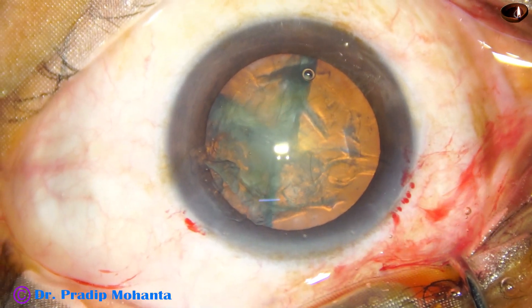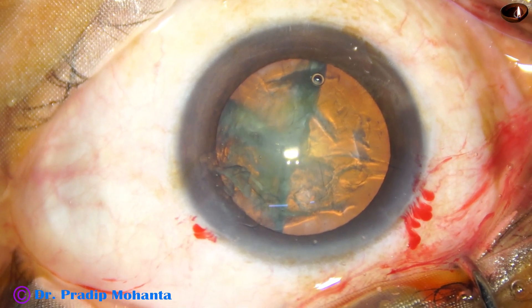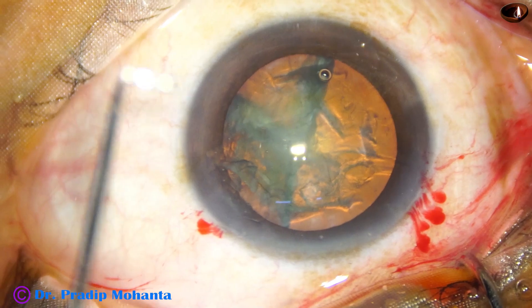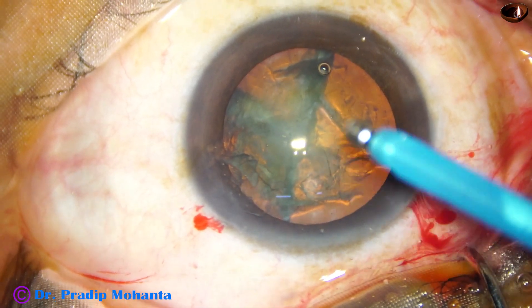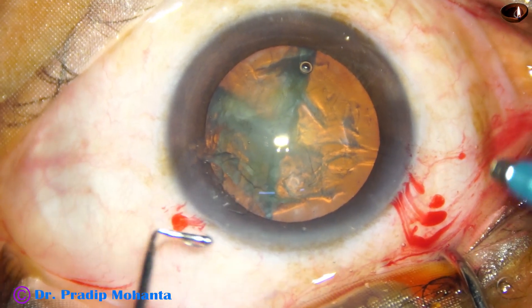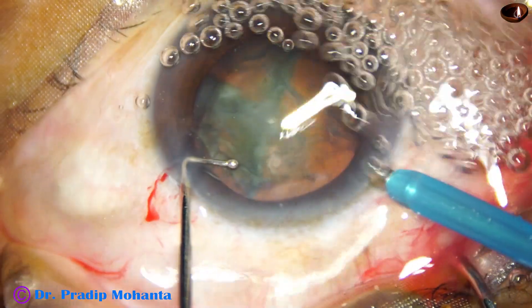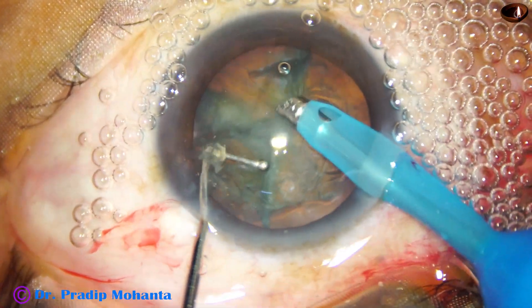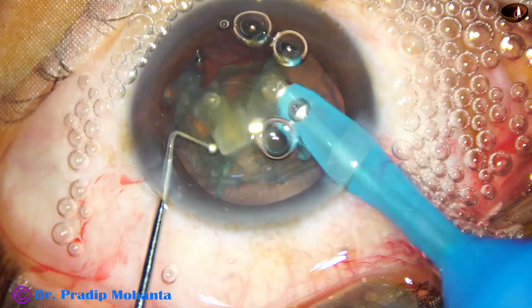We have divided the nucleus into two hemi-nuclei and one hemi-nucleus has been subdivided into two fragments. And now we are going to introduce the handpiece. The handpiece goes bevel down, and some superficial lens matter is removed. Immediately one piece comes to the tip.